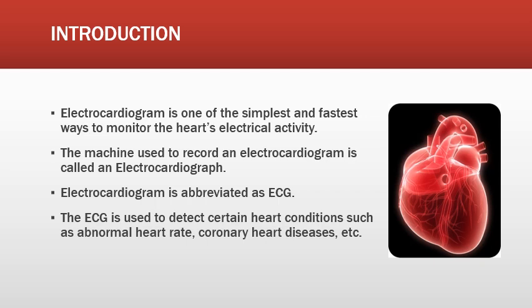Normally, people get confused between an electrocardiogram and an electrocardiograph. The electrocardiograph is the machine used to record an electrocardiogram, while the electrocardiogram is the test. Electrocardiogram is commonly known as ECG. In some parts of the world, it's also called EKG.